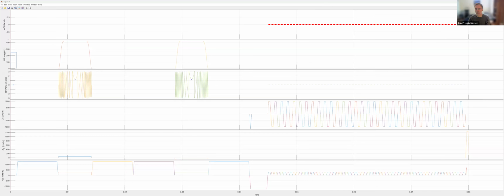Yeah. Can I just second that point? In the end, you can manually define and alter the various RF and gradient events that go into add block. So the MATLAB or Python toolboxes are useful, but generally, I think you still want to check what it actually makes and to see if that's exactly what you want.